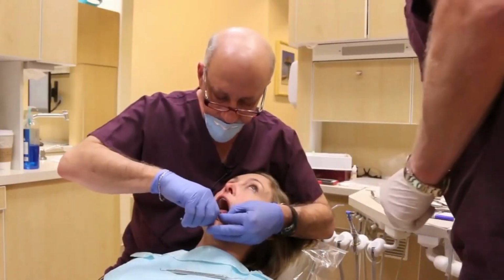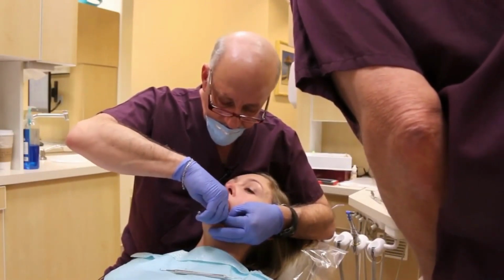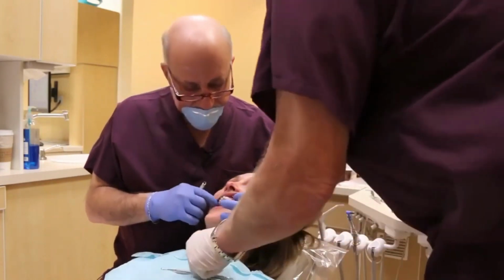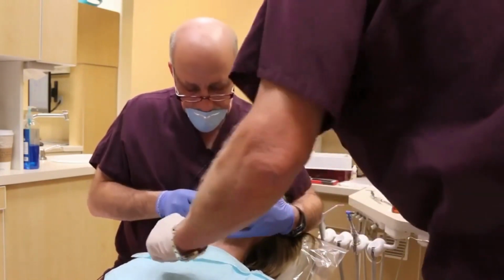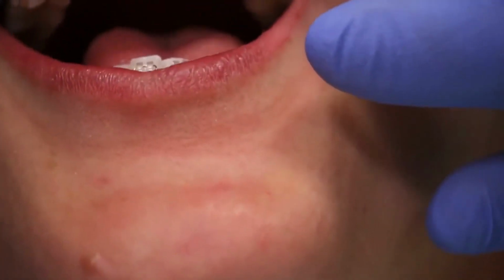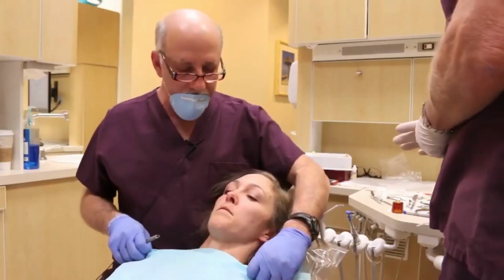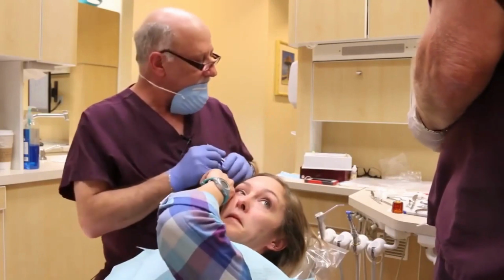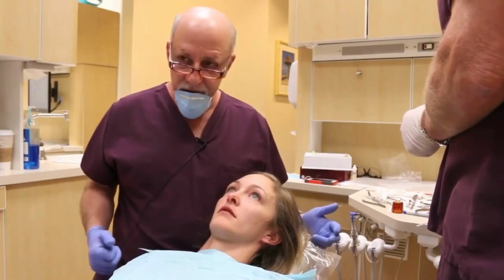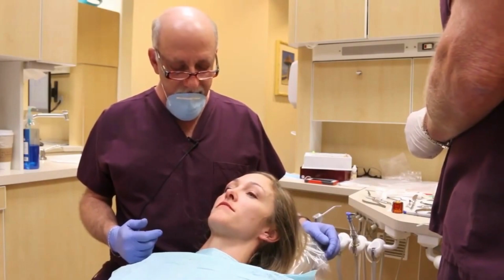There you go. And now we just push in the last two pigtails. And you can see that just with the time that we have spent tying the wire, most of the color is gone. So no carnival for you. Yay. So at this point, we're done with the bonding of the upper and lower 5 to 5. This is the time where the patient gets oral hygiene instructions, where the patient gets flossing instructions, and then we'll see the patient in 6 weeks.